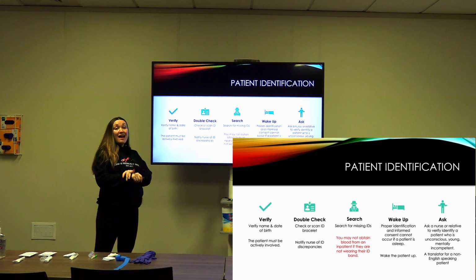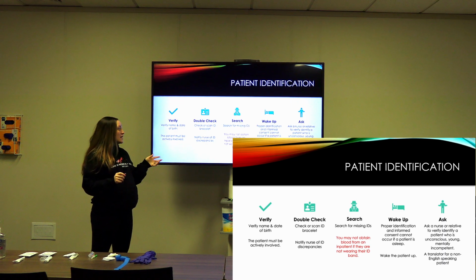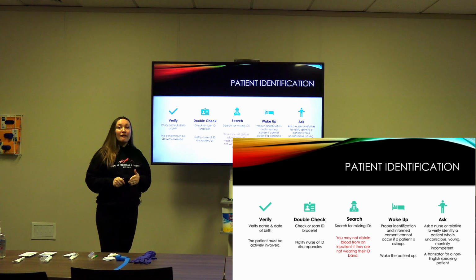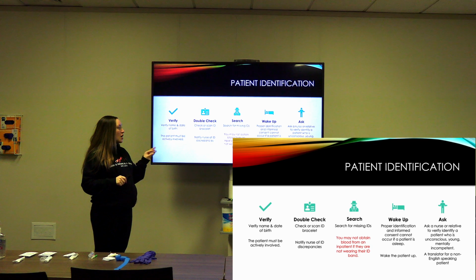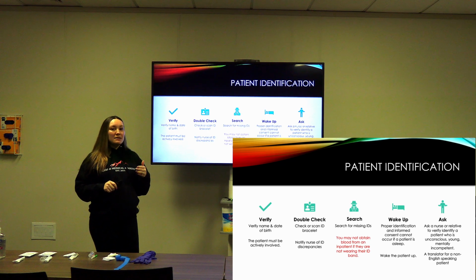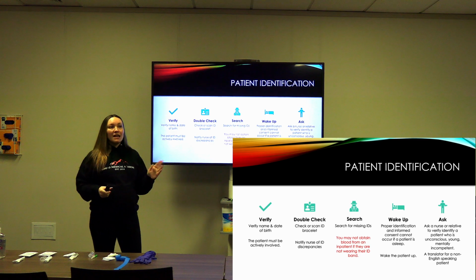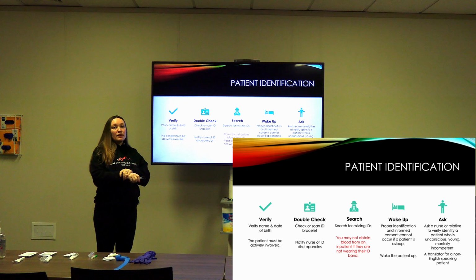If a patient doesn't have an ID band on their wrist, okay, you need to let the nurse know. And this is in the hospital setting, of course, but you have to let the nurse know. If they don't have an ID band on in an inpatient setting, you are not allowed to draw blood from them. You cannot obtain blood from an inpatient if they are not wearing their ID band. Sometimes you'll see the ID band sitting on the counter by like the computer. That doesn't matter. If it's in the room, that's great, but it needs to be on the patient, okay?